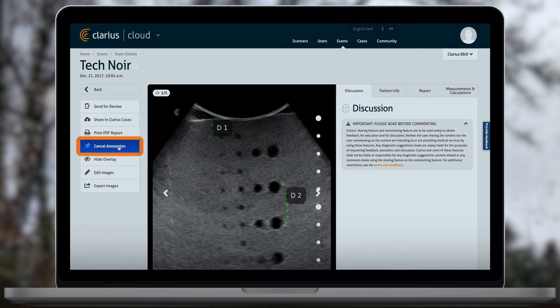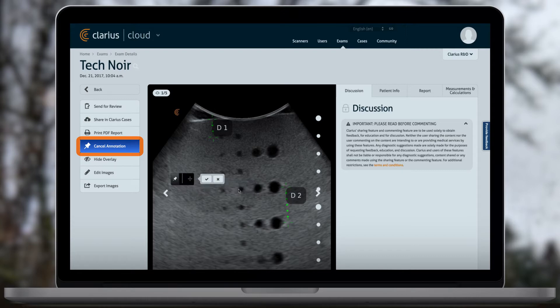To add an annotation that will be displayed on the image, click Add Annotation. Annotations can be edited, moved, and deleted.